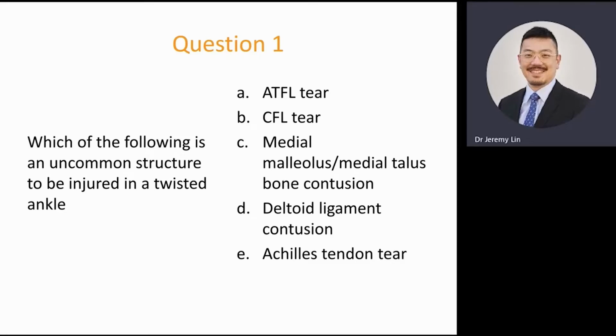Now, the reason I'm asking this is because that's the next one that we're going to talk about, and it will highlight some of the things I was talking about with imaging modalities and why MRI is probably the best imaging modality to use. So I'll just give everybody some time to put their answers in.